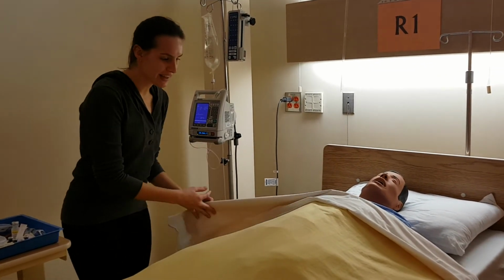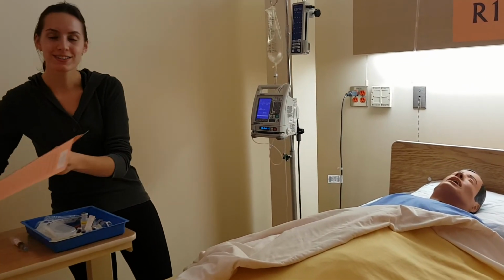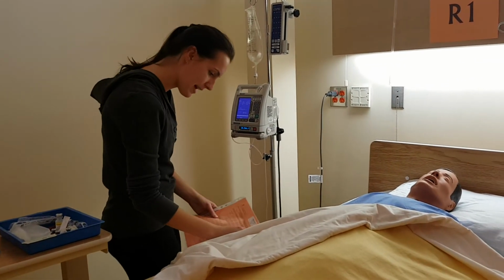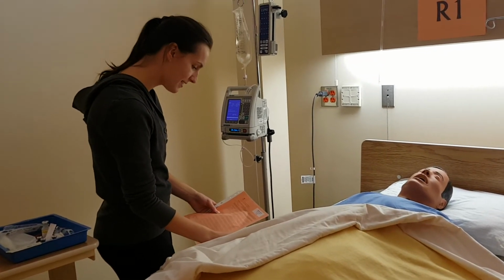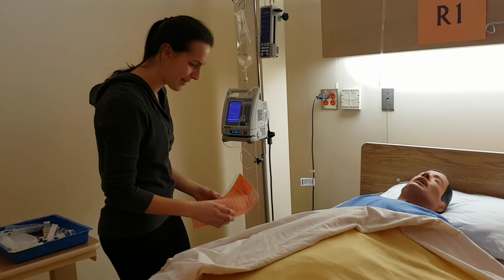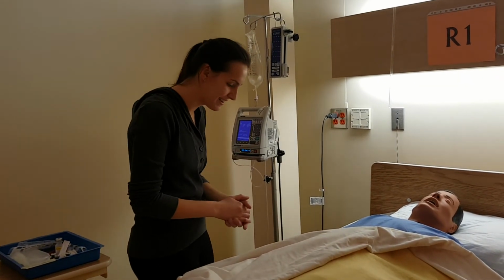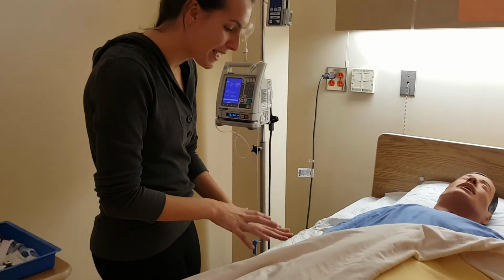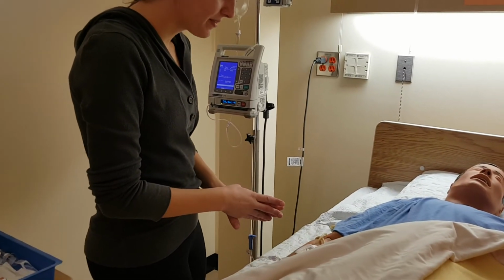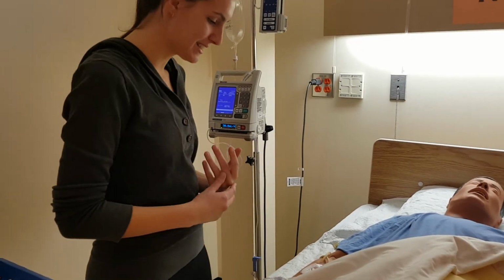I'm going to ensure that it is the correct patient by comparing my MAR to the wristband. Now, can you please tell me your name and your birth date? Sounds great. And while I'm here, I'm going to inspect their IV site. I see here there's no signs of redness, swelling, or pain at the site. Therefore, it's not indicating any phlebitis or infiltration being present.